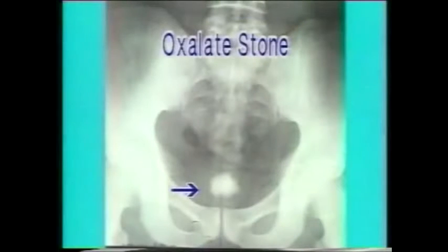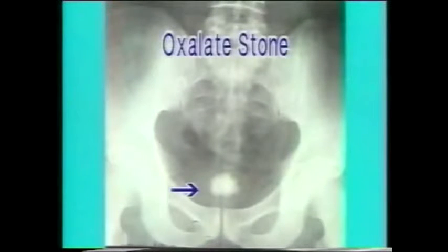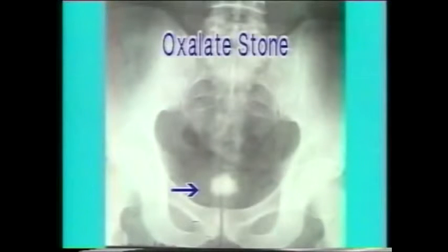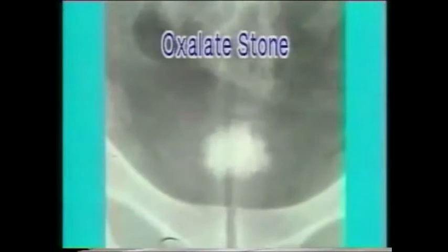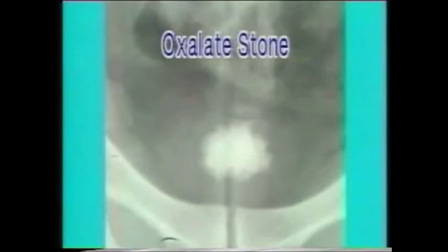This is a typical oxalate stone. It casts a very dense radio-opaque shadow and has a spiculated margin. In a closer view, note the spiculated margin and note that it is much denser than the bone shadow.